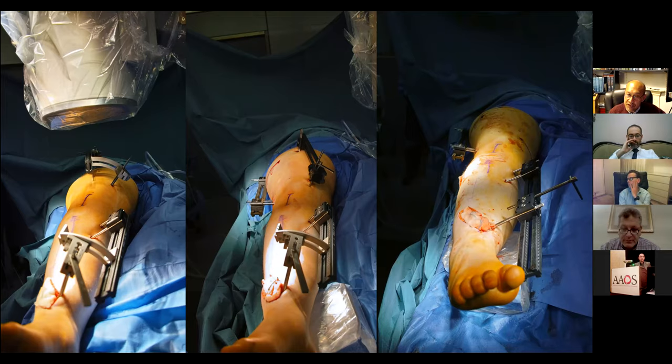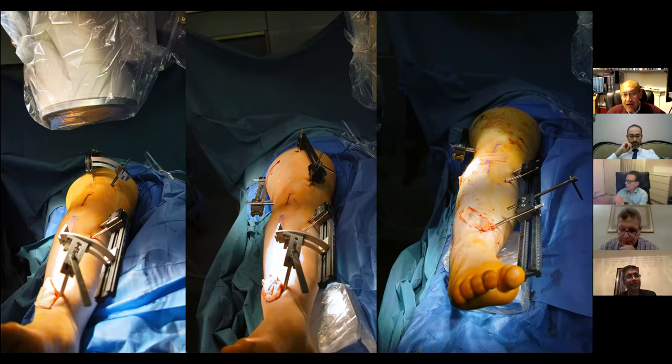Once the derotations are done, in the middle picture, the femoral derotation has been done after the osteotomy. The anterior fixator is holding the derotation. I'm now applying a second fixator laterally out of the way of a femoral nail so that I can nail this derotation and remove the anterior fixator before nailing. With the tibia, it's fairly straightforward because we are doing an open plating of the distal tibia. So the derotation is to get the angles correct.